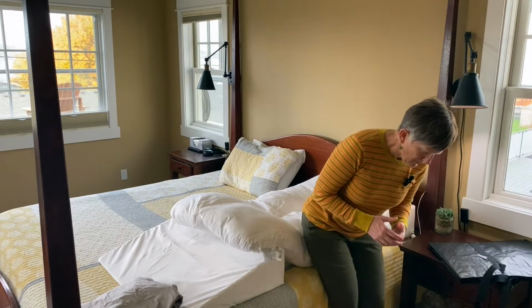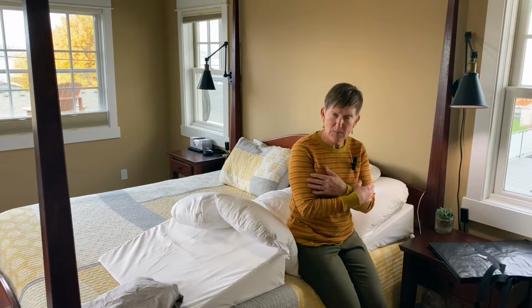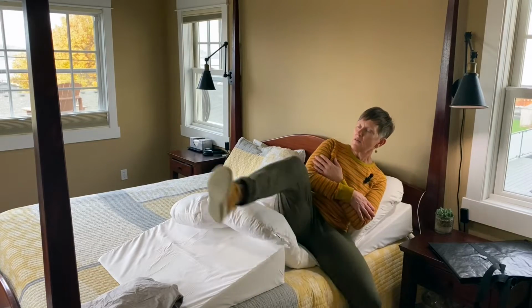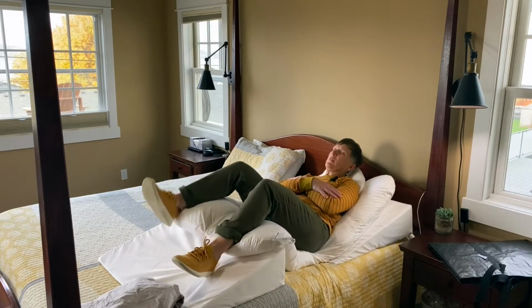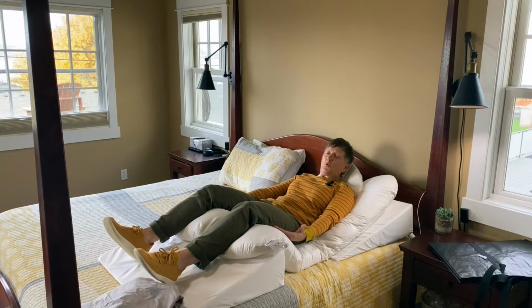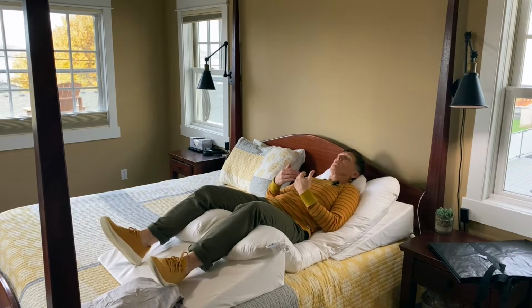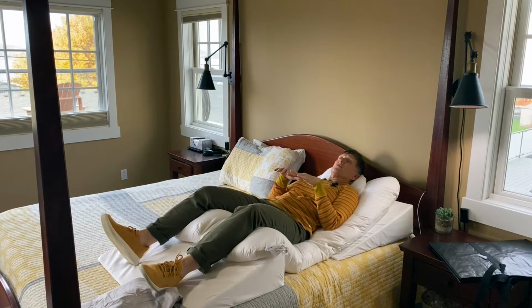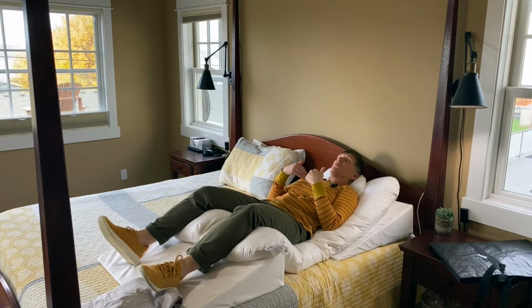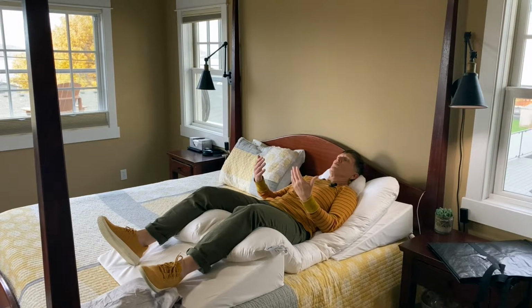So I scoot up, but first I'm having my arms up close to kind of protect my chest because you're not going to be able to push off on your arms for a while either. You're going to swing those legs up, scoot the hips in. Legs are supported on the pillows. Arms are supported on the pillows. Spine fits just nice in that little space in between where the pillows don't meet. And it's a very comfortable and supported position.